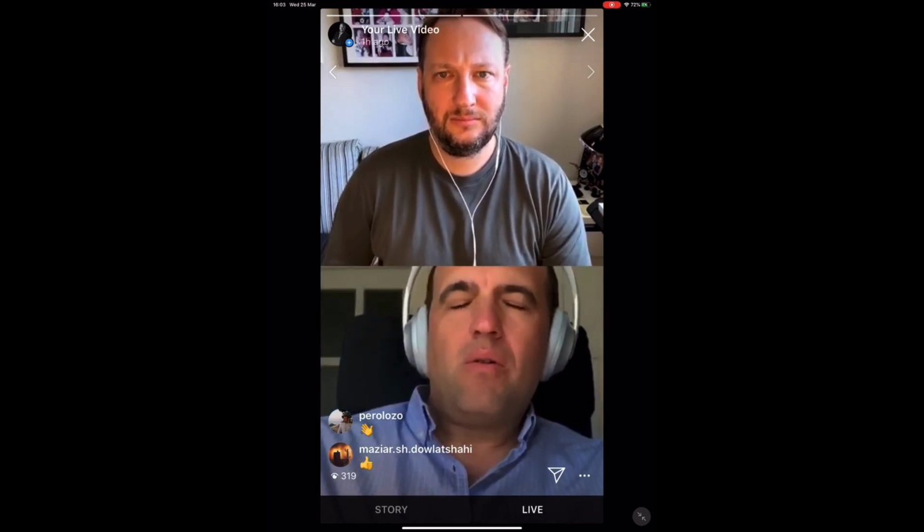Then we are going to record a video. It's very important. Remember that all our cases are planned with the digital smile design principle, so we need the dynamic analysis of the patient. To prepare the dynamic analysis, we need to record a video and try to get a big natural smile, because when you say to the patient, okay, smile, you do it like this, but it's fake. It's not the natural smile. So when you record a video and stop it, you're going to get the best natural smile that we are expecting for the diagnosis.